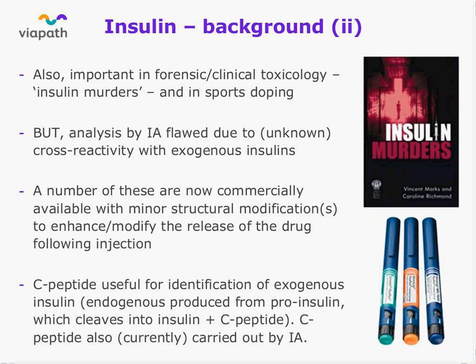The other interest in insulin, and this is perhaps more where my background comes into developing this assay, was from a forensic or toxicology point of view, where insulin is still used in cases of homicide. And also it's interesting in the field of sports doping. So we're actually working in collaboration with the Drug Control Centre over at King's College London, who obviously do the Olympic testing, and so they're very interested in adopting this methodology perhaps for the 2016 Olympics.